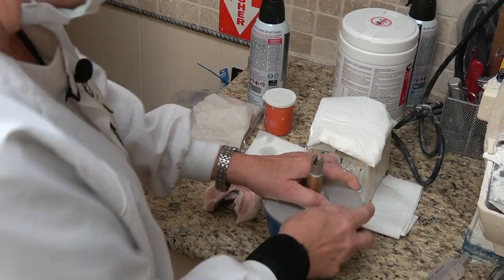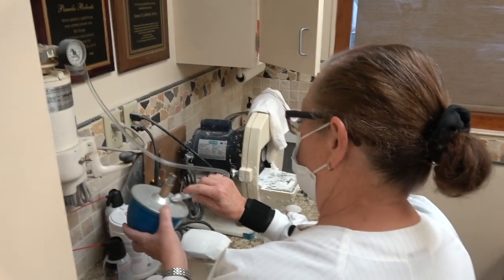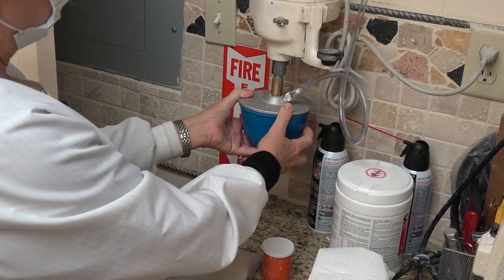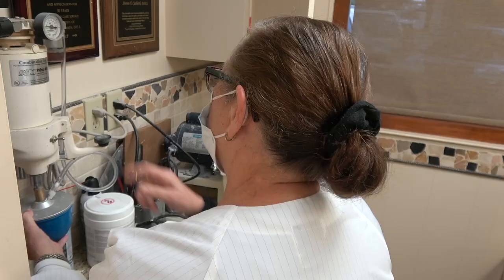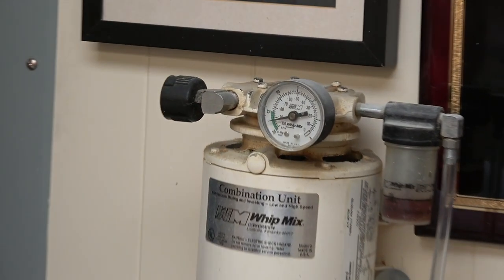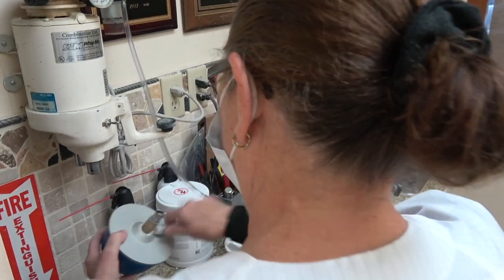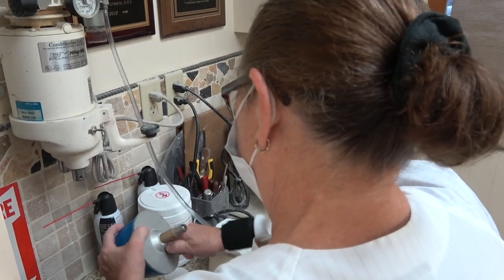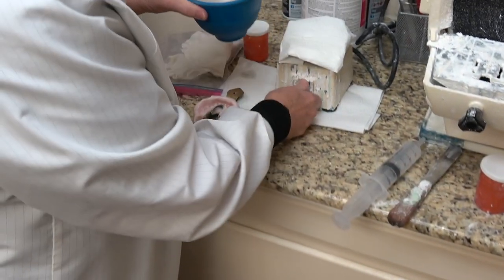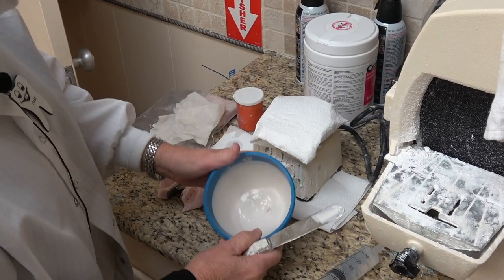Then I put my lid on — this is a Whip Mix system. Put your little vacuum hose on; this vacuums out all the bubbles, and then it mixes. You want to make sure it's in the green when it's vacuuming out all the bubbles in the material. Turn on your little machine, and you don't want it real high — you want a low vibration, the lowest one you have.